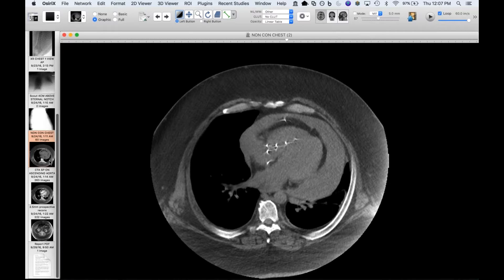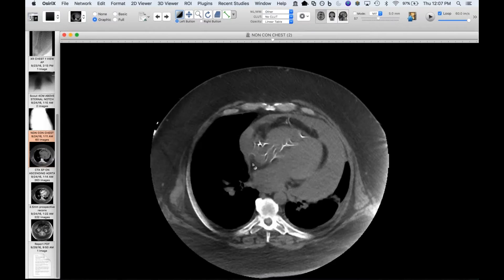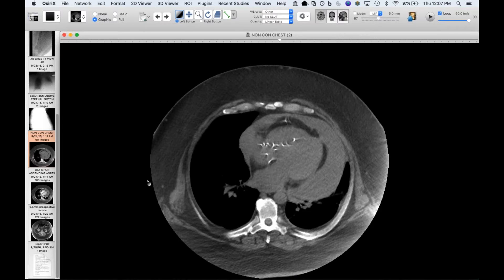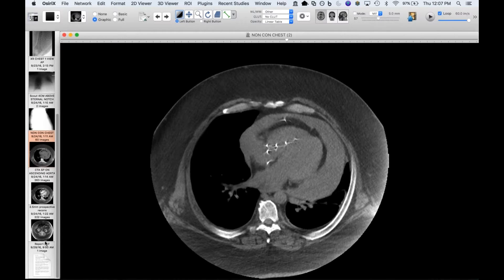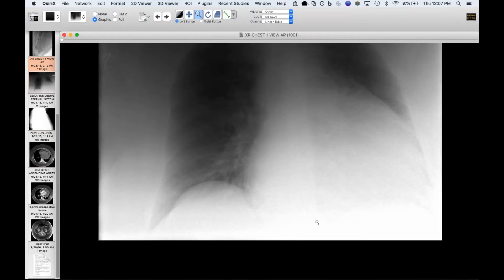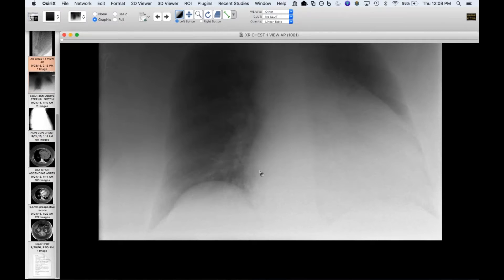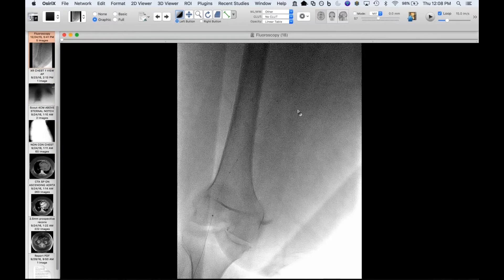It's unclear if they just forgot to take it out, or if he left AMA, or if a portion of it broke off and they didn't realize what they removed was shorter than what they'd put in. We'll probably never know. The radiograph is a good one — the heart is huge and this guy is so big, but you can see those tiny little markers. This looks like what you'd normally see centrally when they do catheter-directed thrombolysis in the setting of massive PE, but in this case it had embolized. These are relatively long catheters.